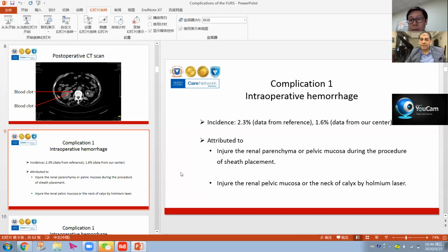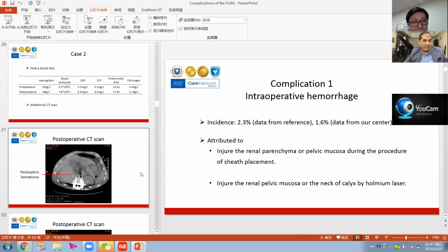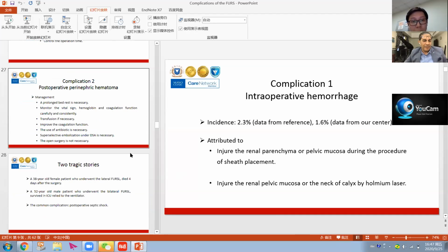Thank you, Dr. Farhan. Yes, we have another question regarding the thin parenchyma in case 2 and case 3, and where there is a hematoma or sepsis. He elaborated in the third case on sepsis, where the patient received preoperative antibiotics and despite this developed urosepsis.